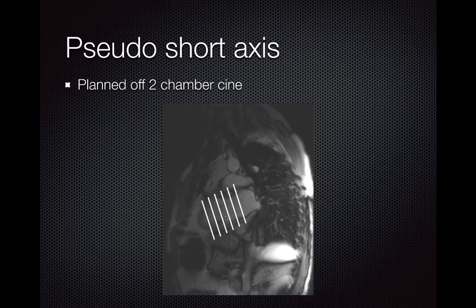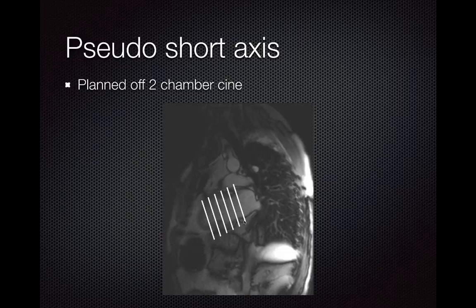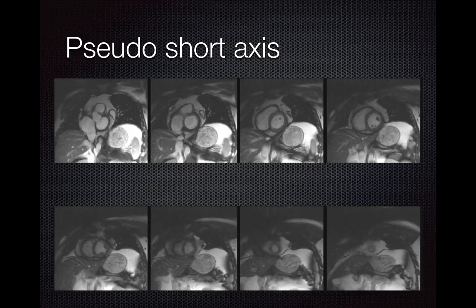From the two-chamber view, we set up and acquire a stack of short-axis images. We align the plane of the short-axis images with the mitral valve — this line is at the level of the mitral valve and lined up in the same plane. We also acquire a few slices into the left atrium, which will be needed later for the LVOT view. Here's our short-axis stack, with at least one image extending into the left atrium and the rest going through the left ventricle.